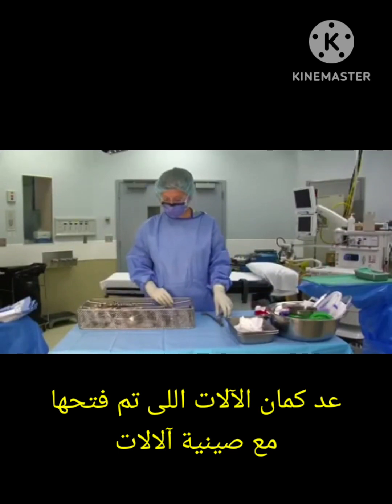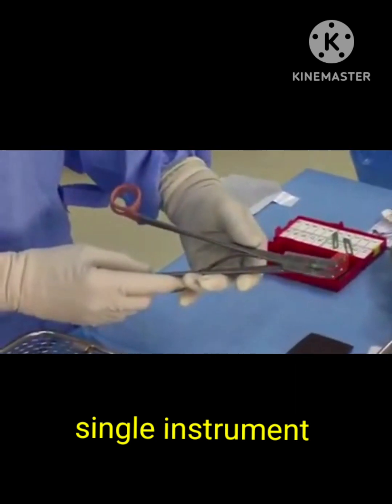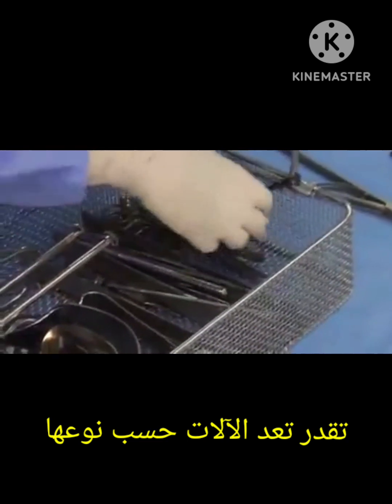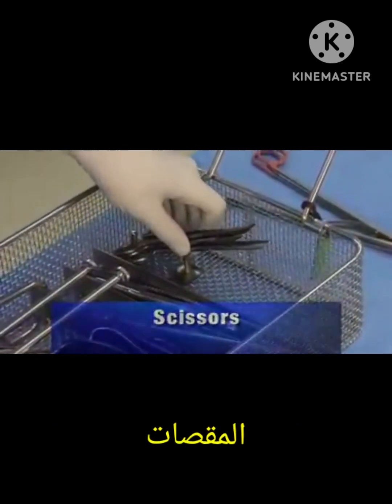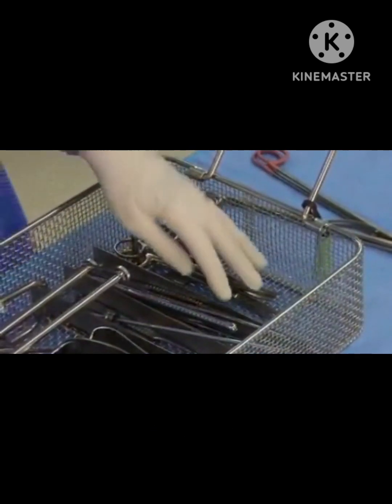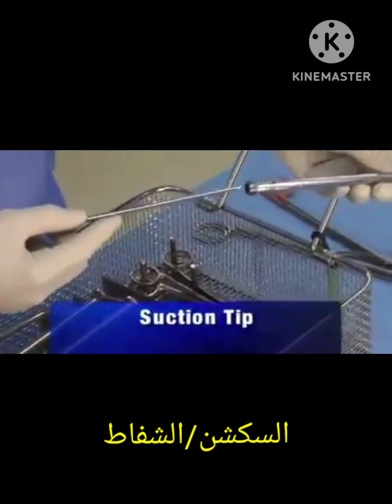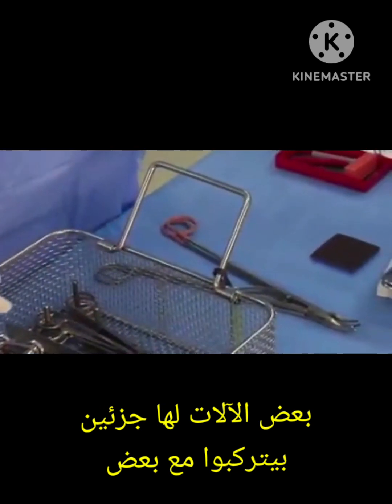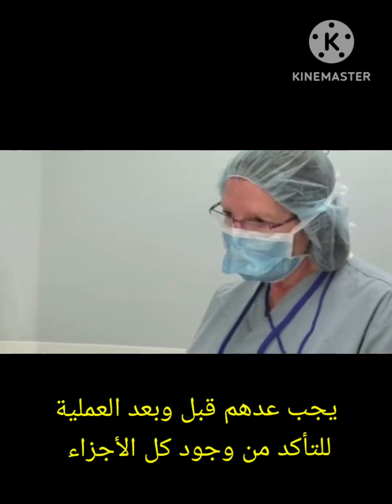Sweep across the table and count slowly enough that the circulating nurse can clearly see the tips or identifying aspects of each instrument and can record the item. Start with any instruments that have been added, such as clip appliers. Moving to the pan, name the instrument first and then count — for example: scissors, one, two, three.